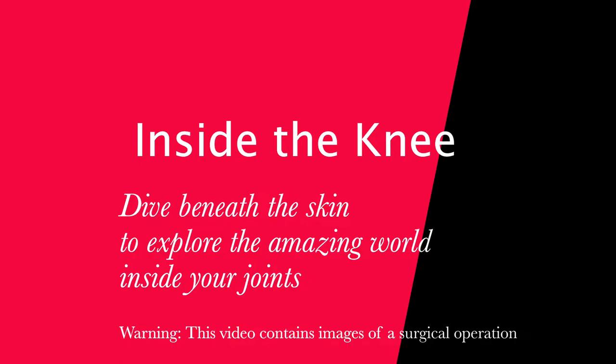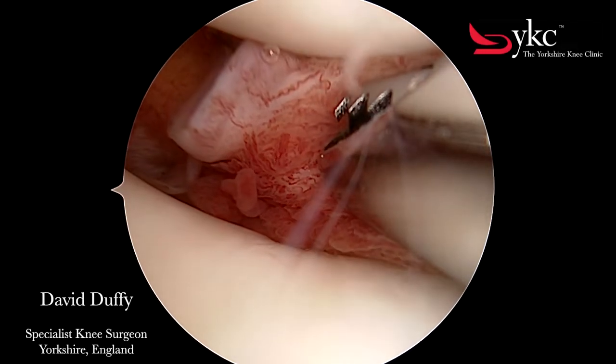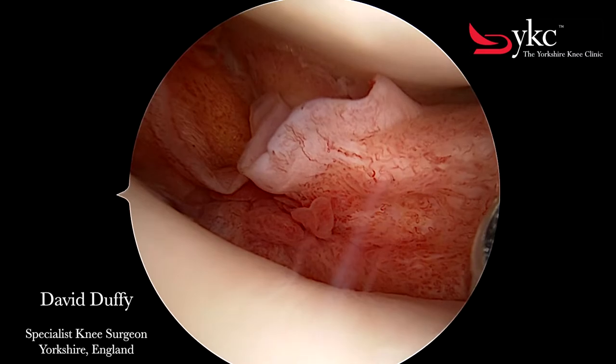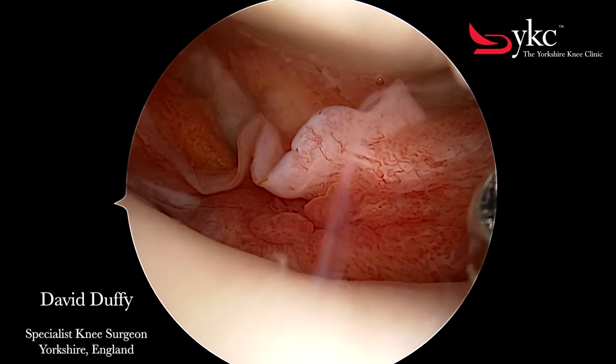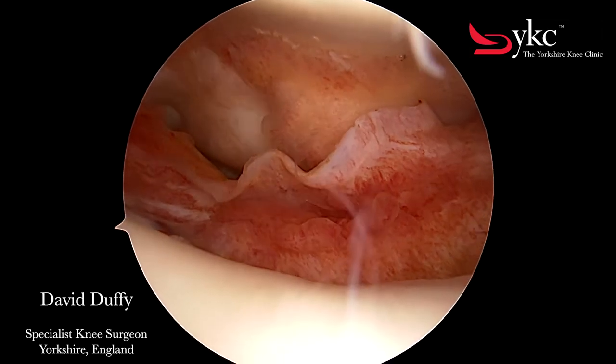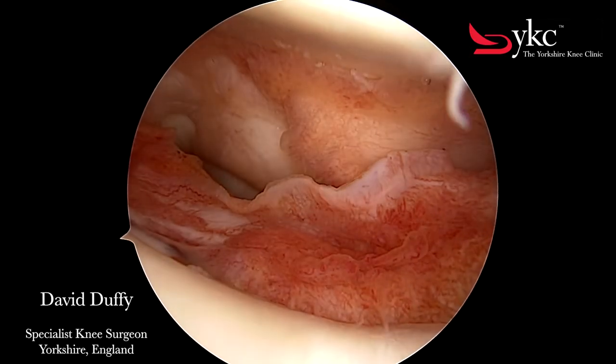You can see the anatomy of your joints in HD by inserting a small camera with a powerful light attached, and then slowly injecting a clear fluid to distend the knee. As the fluid is injected you can see the lining of the joint rolling back, looking like coral under the sea.